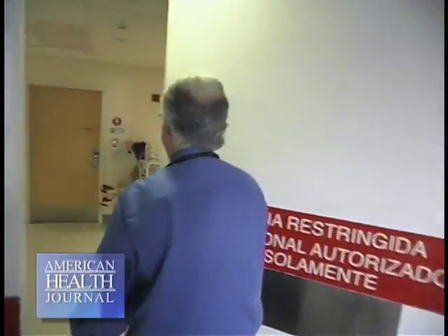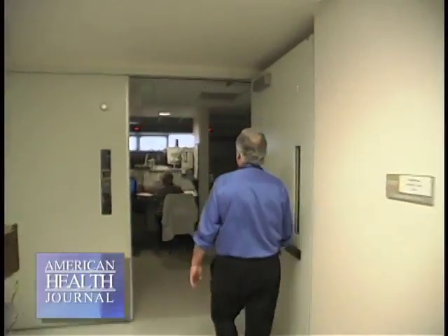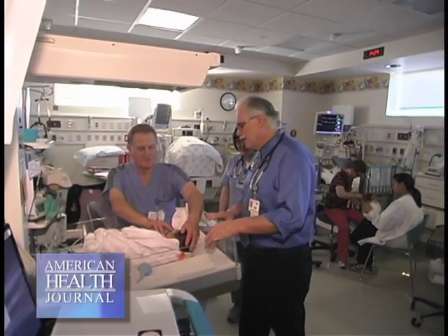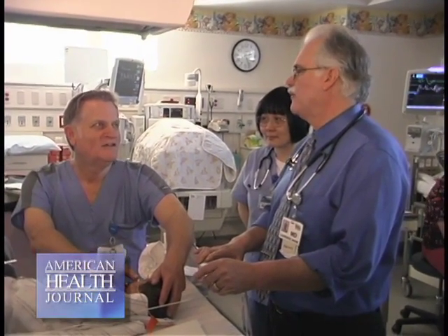What it is, it's a way to take a baby's core temperature down to about 33 degrees. It is cool to the touch, but it's higher than even room temperature. Our bodies are usually at somewhere around 37 degrees centigrade. We're only going down 4 degrees centigrade, which is about 10 degrees Fahrenheit, and maintain it there for 3 days while the baby's body compensates for the acidosis and the metabolic problems that he has, and then we rewarm them and see what their function is.